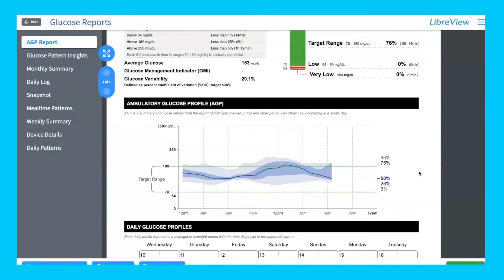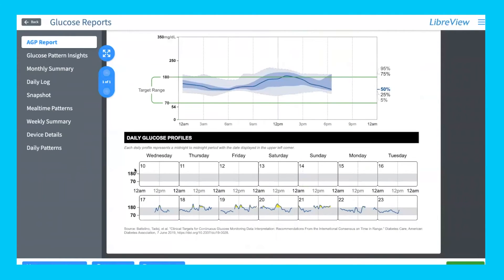At the bottom, you'll see more glucose profiles showing your average glucose, your percentiles and ranges, and your target range — mine is 70 to 180. It also gives profiles more specific in time, so you can look at specific days and specific hours, shown from 12 a.m. to 12 p.m. to 12 a.m. the next day. This lets you see where your daily spikes are, and anything shaded in yellow shows when you were above your target range.